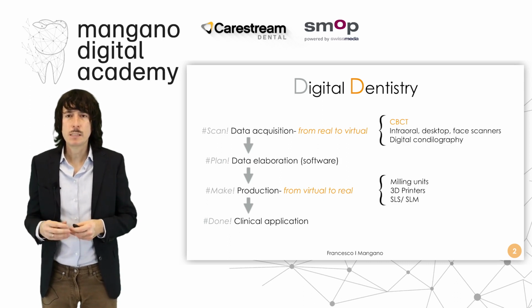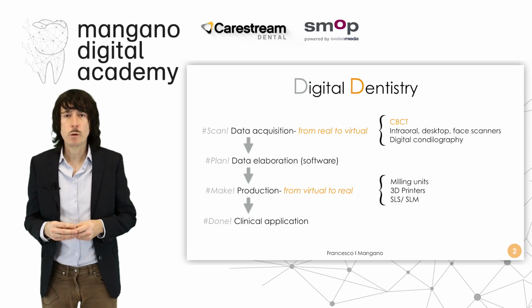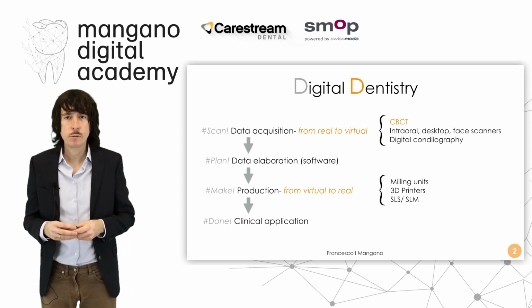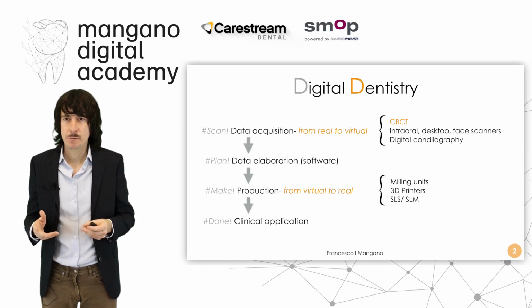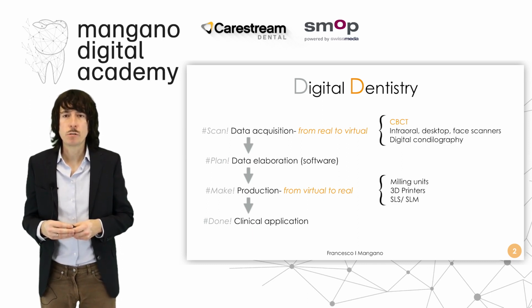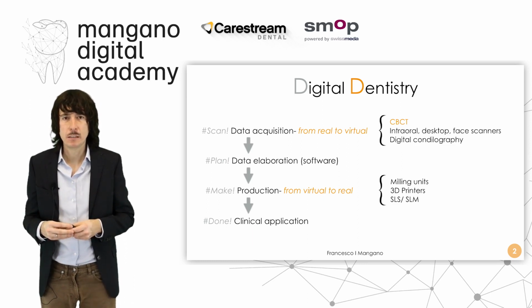There's the scan phase, with the 3D data acquisition from our patient. Then we have to plan using our software, so we have a data elaboration. And after planning, we need to make our devices for clinical application. After that, we need to apply these devices clinically.